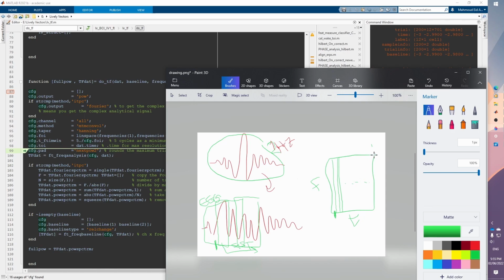And there is a direct relationship between this and the power spectrum. If you are doing a Welch method, if you are taking the average of all of these time points, you will end up with one column representing the average spectrum, and this one column is your spectrum, according to Welch's method. Okay, so that's very quickly what is happening with the time frequency plots.